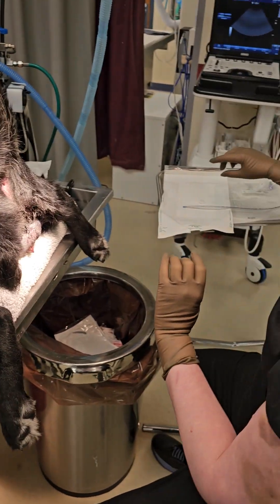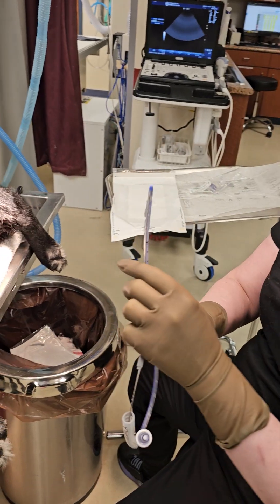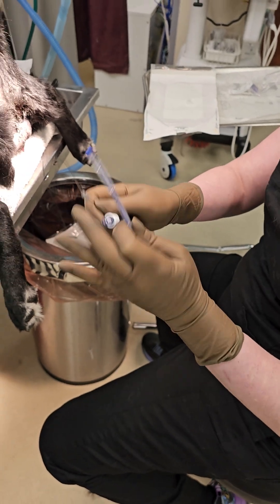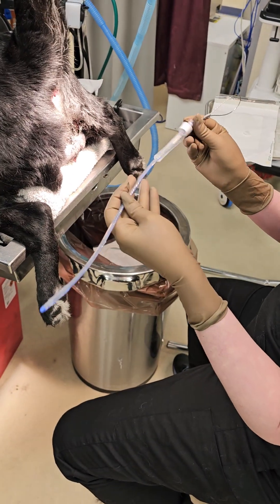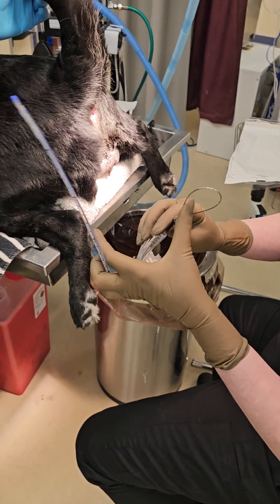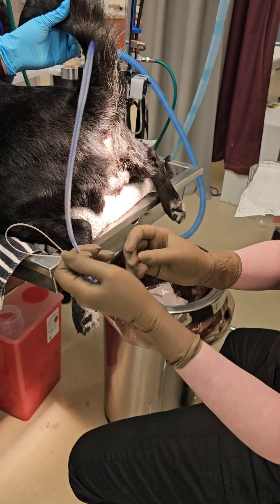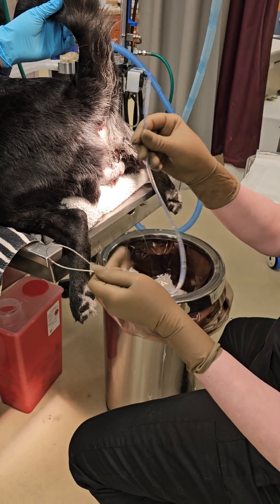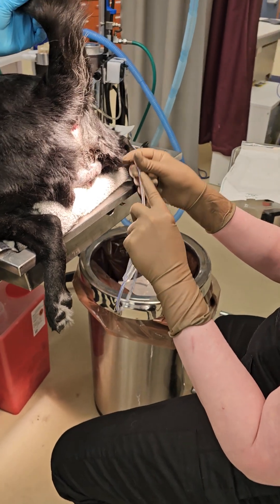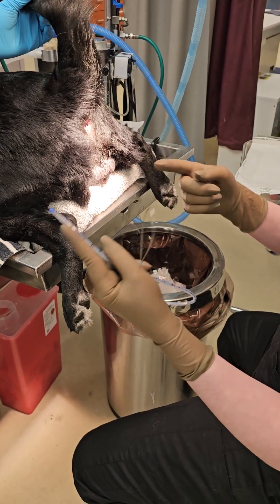The way I like to do this is I will hold this in my left hand, which is my non-dominant hand. You want to make sure that your guide wire, especially on the smaller ones, is all the way to the end. You can put your thumb kind of here to secure that guide wire so that it stays tucked in there. Then I will take it in place and sit it in my hand like this with my finger this way.